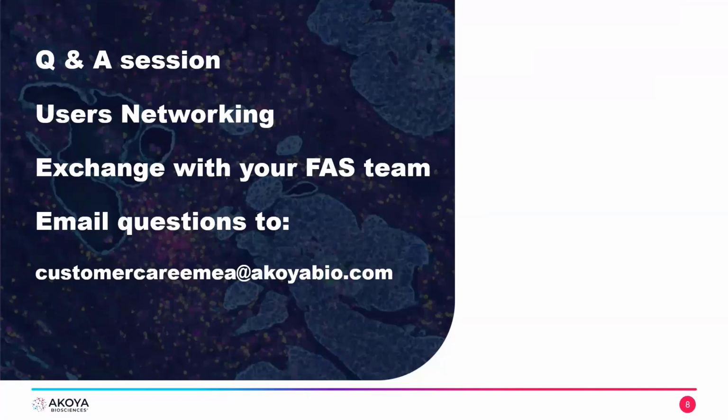So we have been using the LabSat for all the images I showed, but there's no quality issue in our hands. The Leica Bond has been used by another group or collaborators within the Frankfurt Cancer Center, and they do report fine staining. It's just the amount of slides you want to process, but we're establishing, and we also have two LabSats at hand, so we can do staining simultaneously. For our initial purposes, we are fine with that because it also needs some time to analyze the slides. So quality issue should not be there.